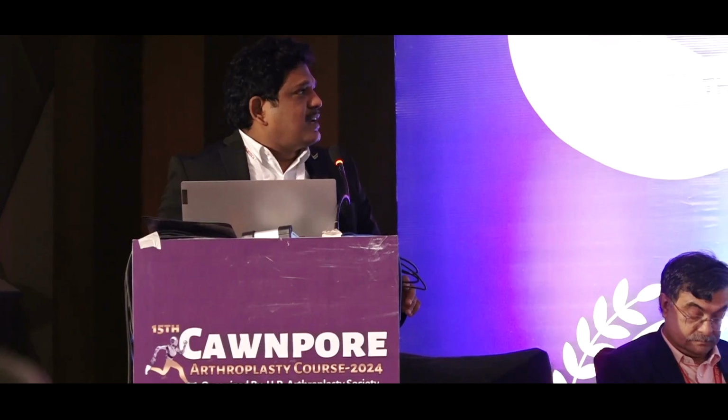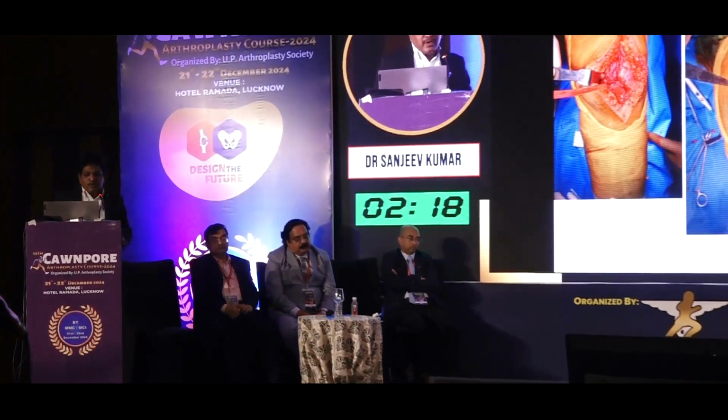I will be showing two cases. One case is a 28-year-old young female, a post-septic arthritis knee, healed, very painful, with very little arc of motion from 10 degrees to 30 degrees of flexion. As we started and did the arthrotomy, the patella was adhered to the underlying structure. So after release of the patella and all the fibrotic tissue in the suprapatellar pouch and the gutters, we were able to sublux it.